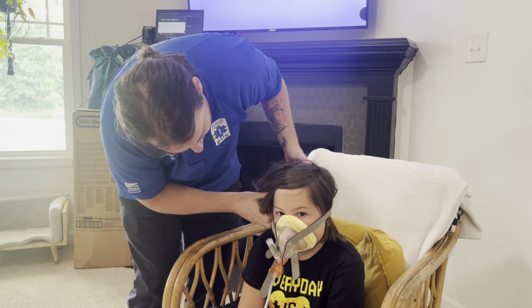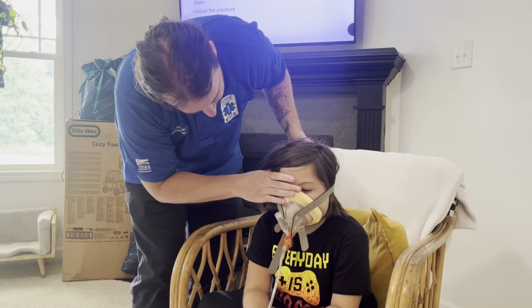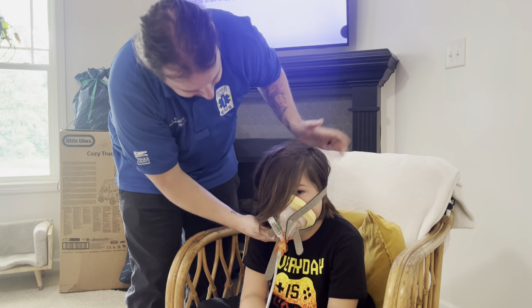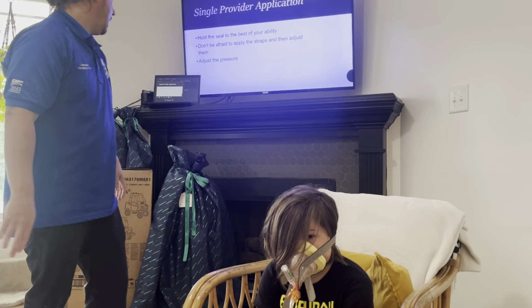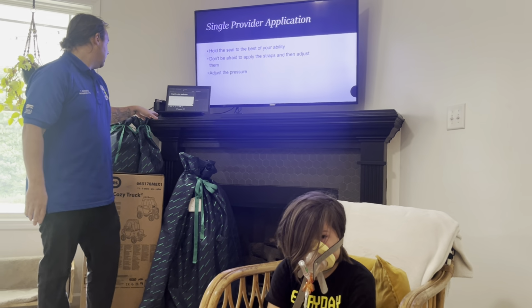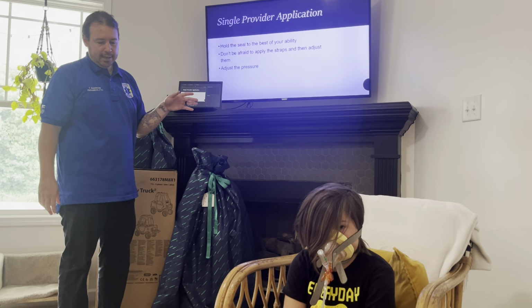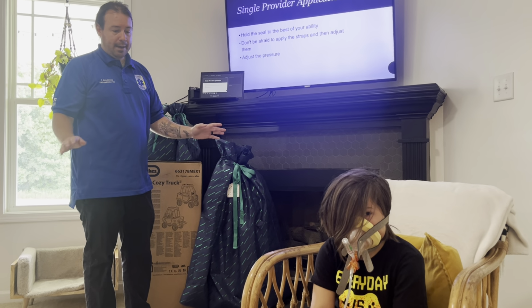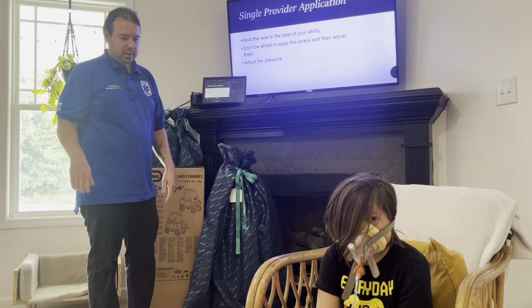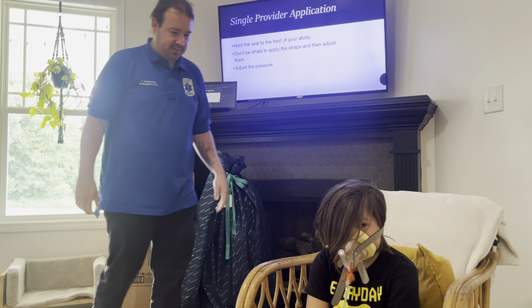All right, now try to breathe. Breathe out. Not feeling any gaps, okay? So again, once we're done with this, we'll go ahead and reassess, monitor vital signs, and look for trends in vital signs to make sure that we are not missing anything. But that is how you apply CPAP.